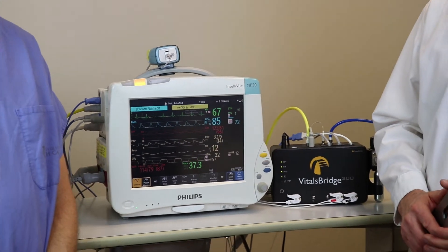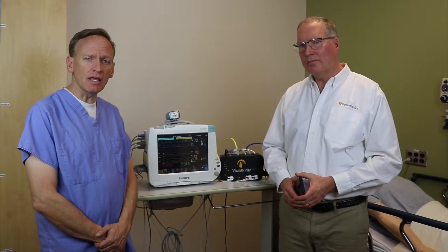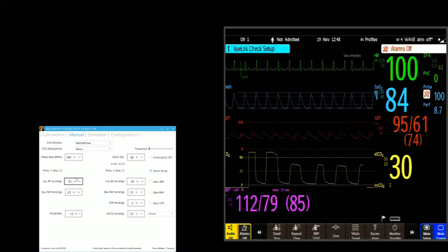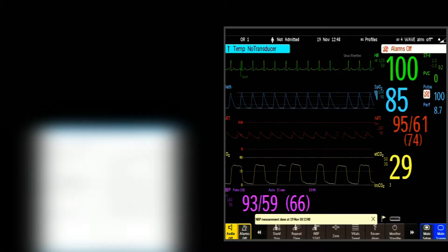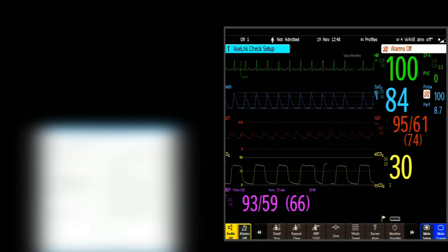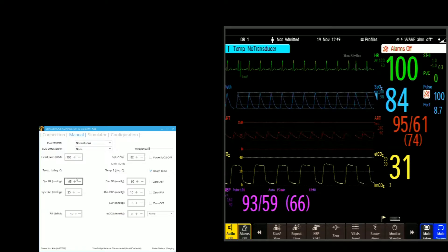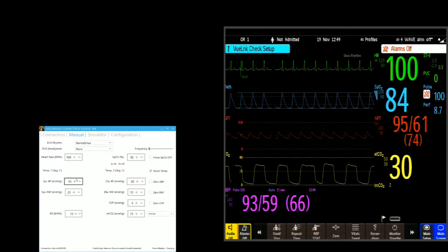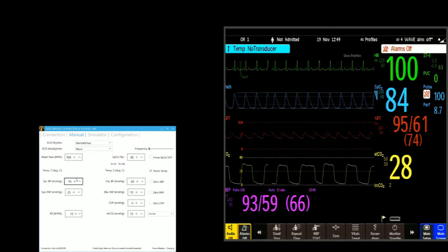There's another way that you can also integrate with a mannequin, and that's using direct integration with an instructor application. In this example, we're going to use Lerdahl's LEAP. On the left side of the screen is the VitalsBridge Connector app — the Windows-based application that allows you to change your vital signs. On the right side is the direct video output from a Philips Intelliview MP70. It's not a simulated monitor; it is the actual video output — a real patient monitor. Some simulation centers will already have PCs set up, and it's very easy to throw an application on and change things on the fly.